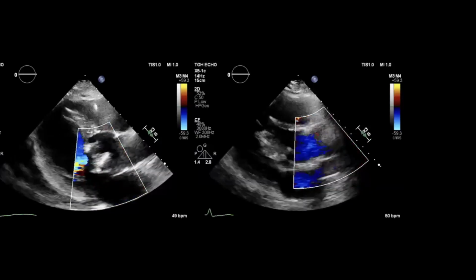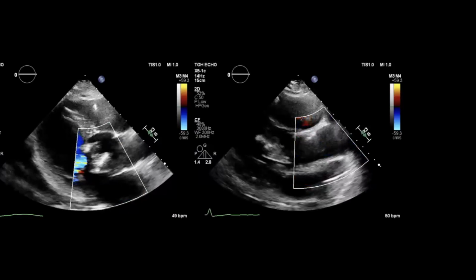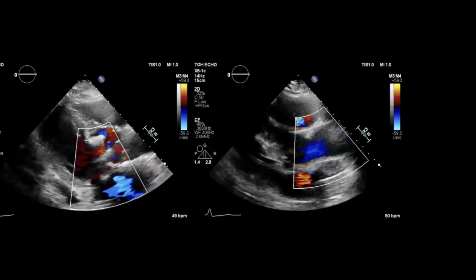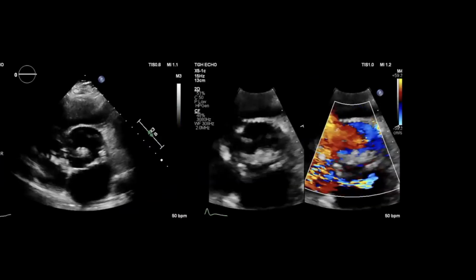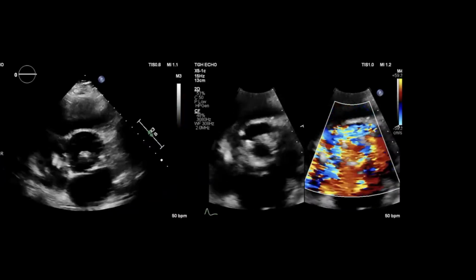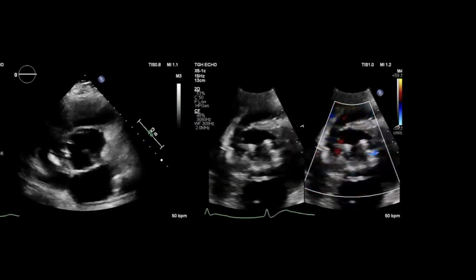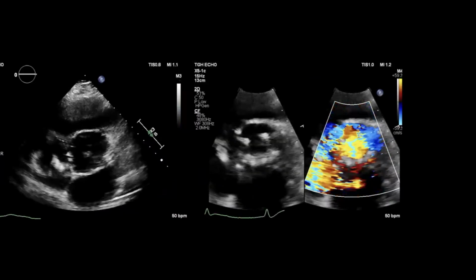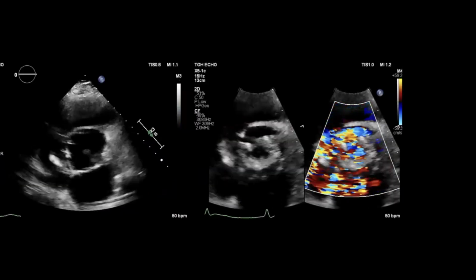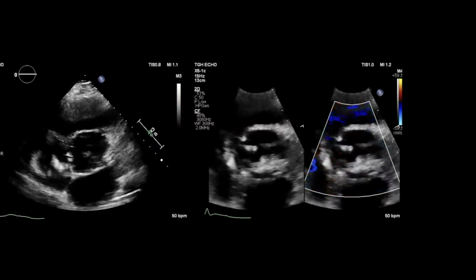All right, so we saw that the bioprosthetic valve, we call it rocking. There's dehiscence, and there's severe paravalvular leak. There's some aortic dilatation as well. These are some short axis images here. And this is an outpatient echo. Gradients are pretty normal and everything's pretty normal like a year ago. I think there was like some mild paravalvular leak.